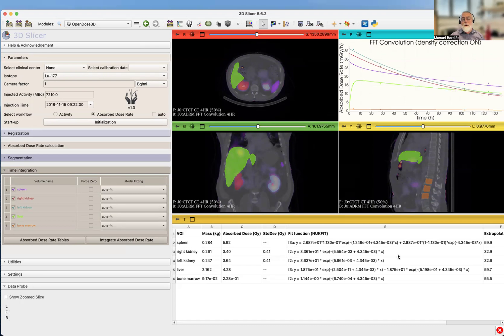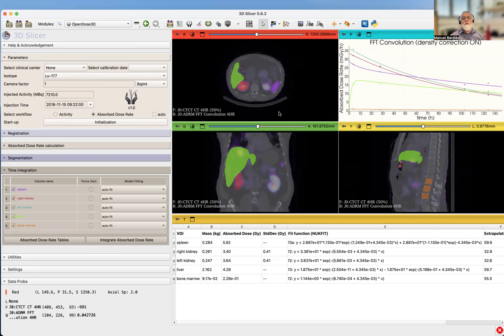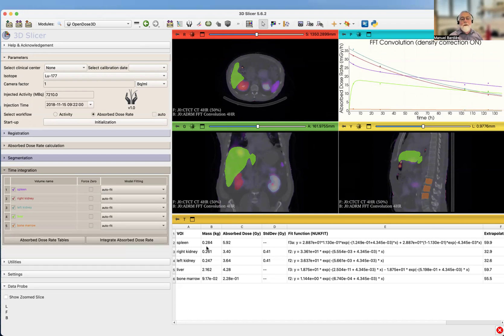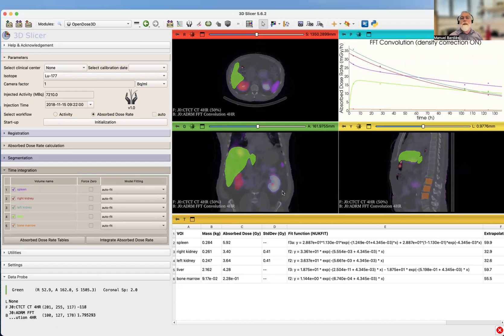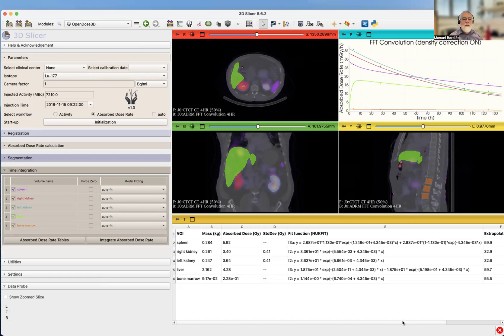With that, you've been doing your first dosimetry using OpenDose 3D. There's a lot of things that need to be done now. For example, we have to do the dosimetry of a tumor, and the liver we have here is a total liver. We have to generate healthy liver and tumors in the liver. We'll see that in a future video. And with that, I thank you for your attention. Thank you.